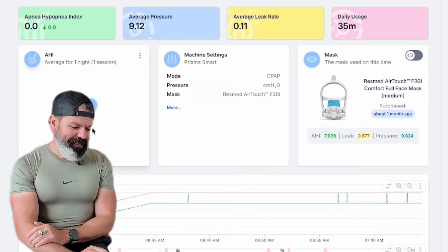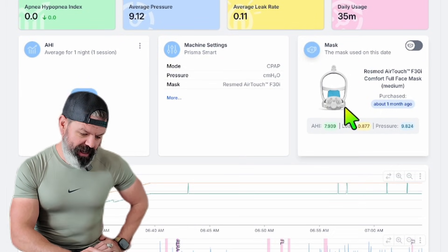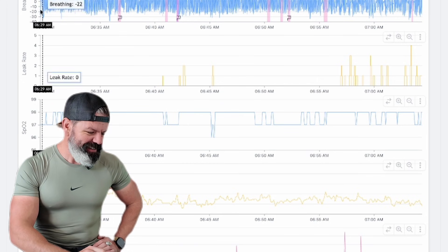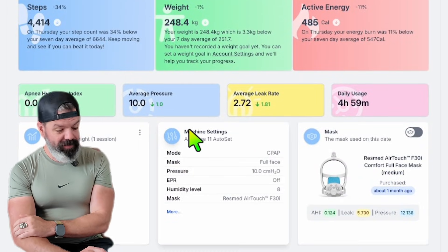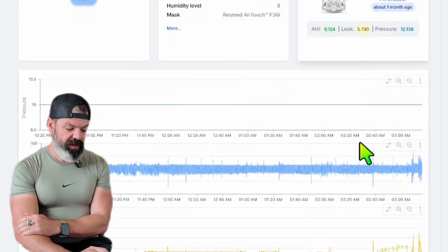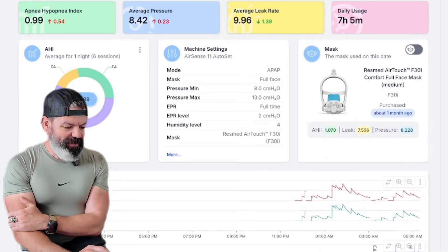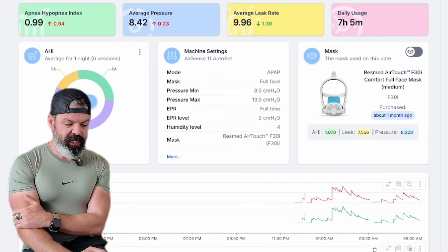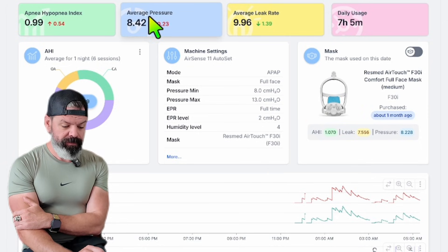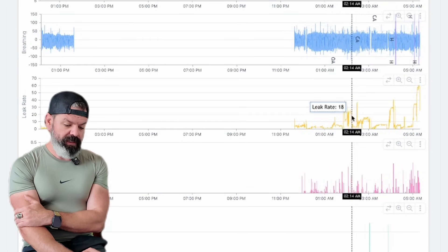Next up we have Nellie — average pressure of nine, average leak of 0.11. With her AirTouch she has an average leak of less than one. We're giving Nellie an A+. Well played, Nellie. Rhett has an average pressure of 10, average leak of 2.72 on this night, average leak with this mask of 5.7 — giving Rhett an A+ as well. Now we have Selly — 8.42 average pressure, average leak is nine. That's high for that low to moderate pressure. Average leak with this mask is 7.5, which is quite high — so we're going to give that a B.